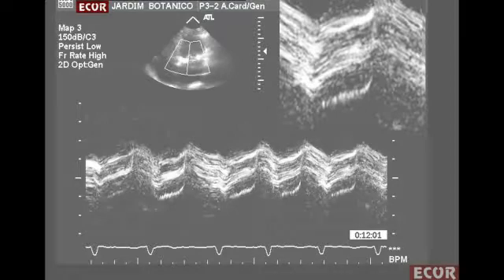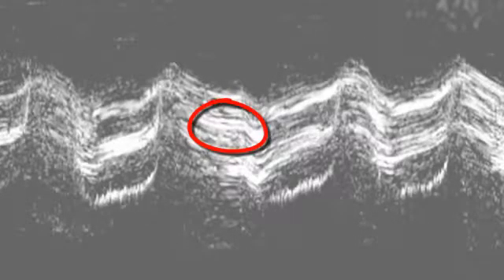Another example: apical four chambers view of a biological prosthetic mitral valve in a patient with endocarditis suspicion. 2D echo non-diagnostic of vegetation. M mode shows some thickening due to calcification. See how these echoes are formed by lines with smooth borders, classical of calcium or plain thickening.